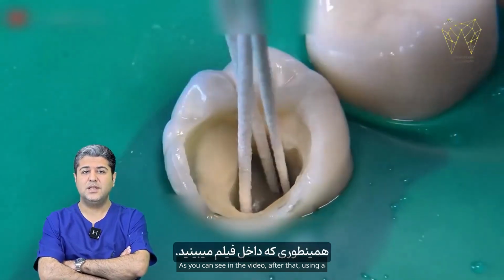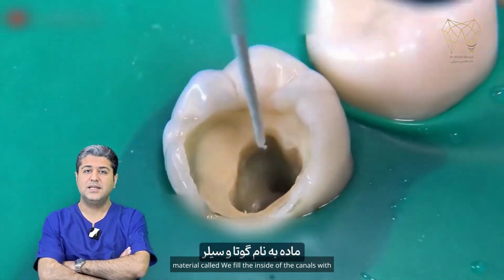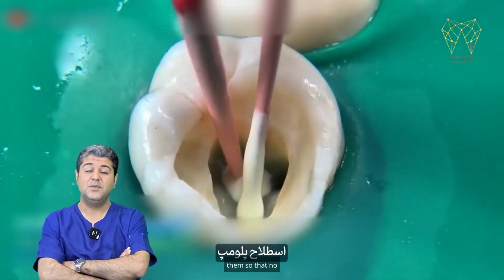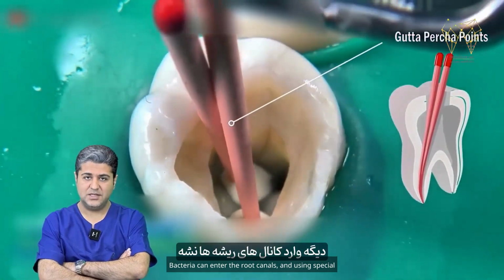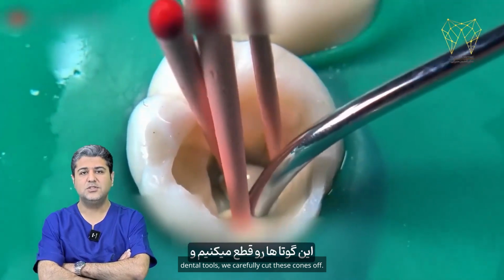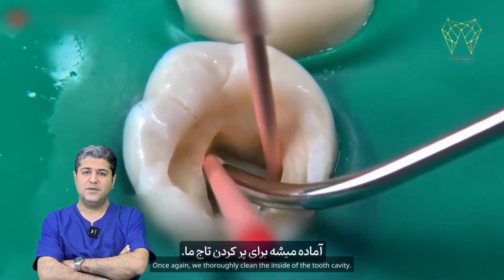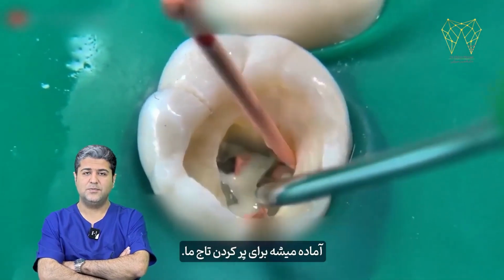As you can see in the video after that, we fill the inside of the canals with gutta percha and sealer, or in other words, we seal them so that no bacteria can enter the root canals. And using special dental tools, we carefully cut these cones off. Once again, we thoroughly clean the inside of the tooth cavity. It is now ready for us to fill the crown.